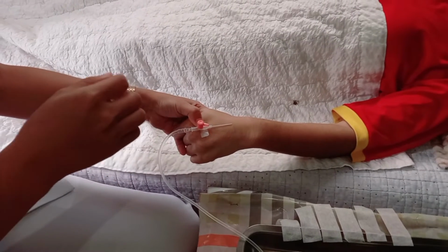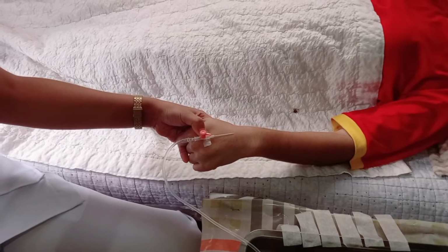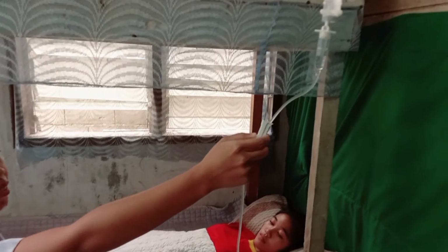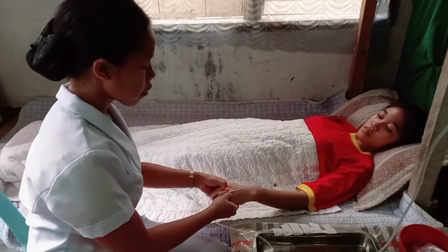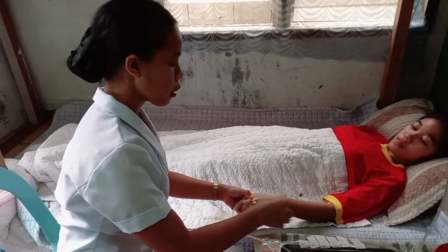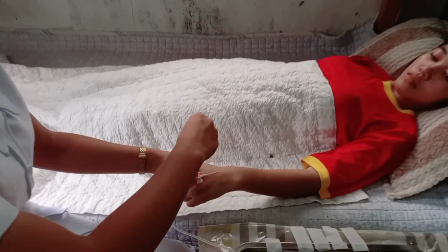So we will start the flow of the solution promptly by releasing the clamp on the tubing. And then after that, we will observe the site for any signs of infiltration. Then we will secure the needle using a plaster.